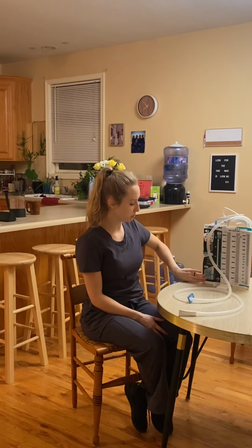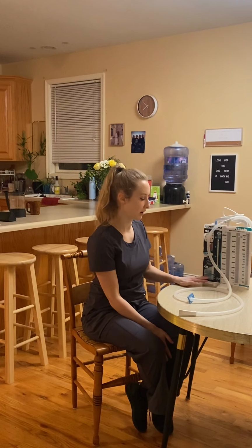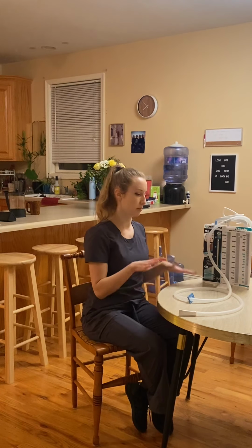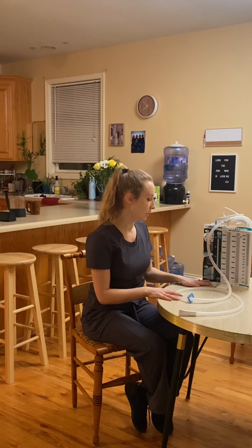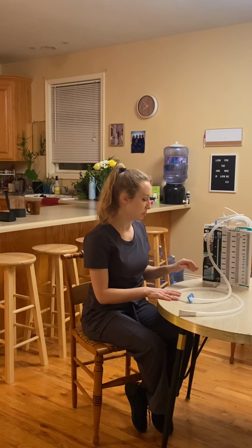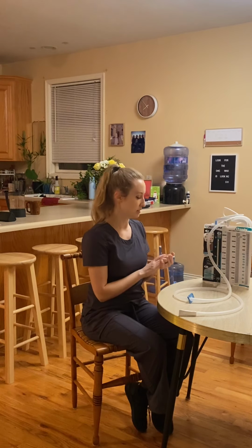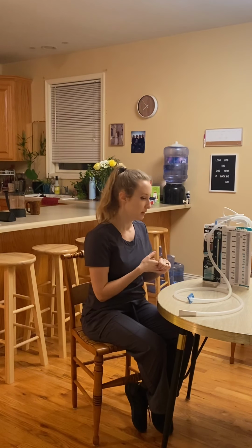You have a water chamber here. It has 2 centimeters of water in it, which is exactly the amount that we want. And what we're watching this water for is it's going to do something called tidaling. So it's going to move slightly, sway with your breathing. It may move more if you're coughing a lot, and that's understandable. But we don't want air bubbles, and we don't want heavy movement in there. It does indicate an air leak or could indicate respiratory distress for you as well.